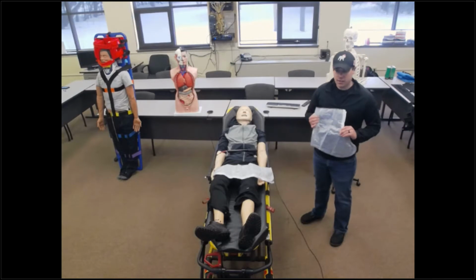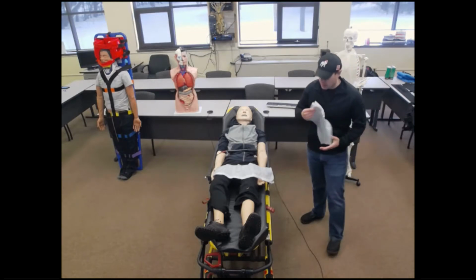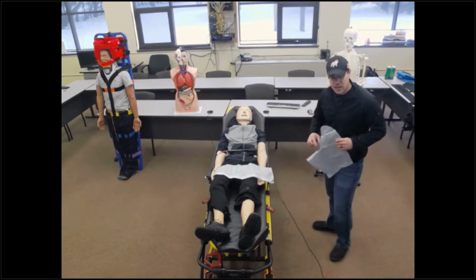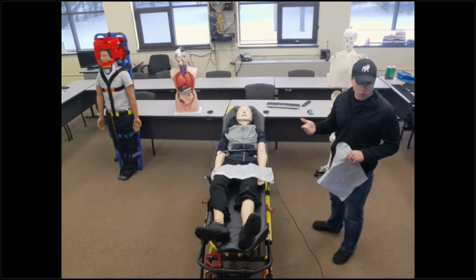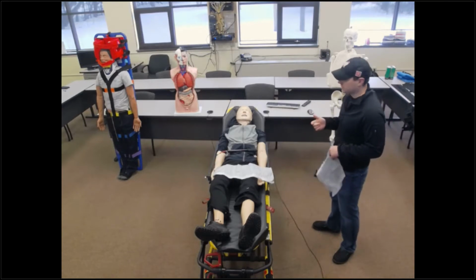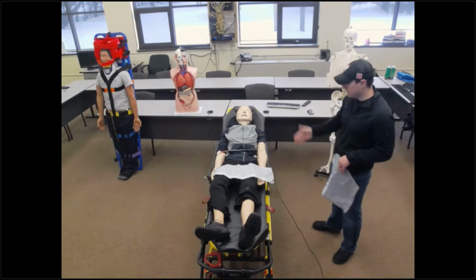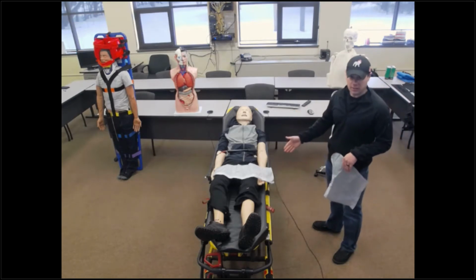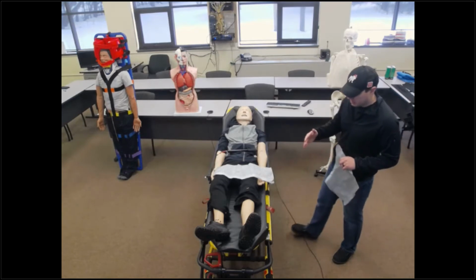As you can see, the air splints come in a variety of different sizes utilized for either the legs or the arms. So this is the boot style air splint. I got my patient. We're going to say that they fell from a ladder. Patient's alert and oriented. I conducted my trauma assessment and I've identified that this patient's got a left ankle injury and a left arm injury. I got my BSI on, my scene is safe, conducted my assessment.